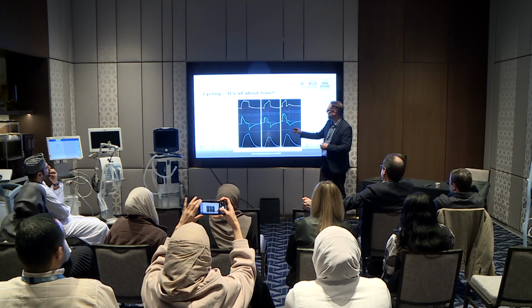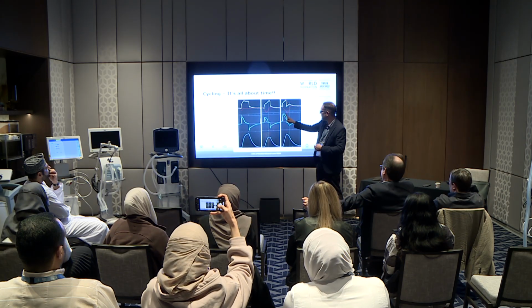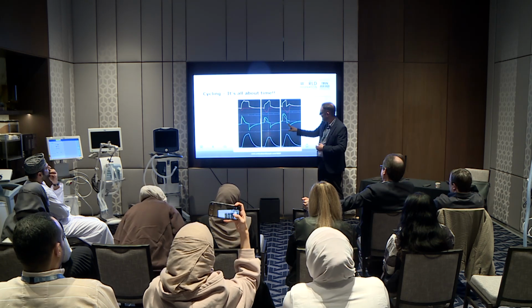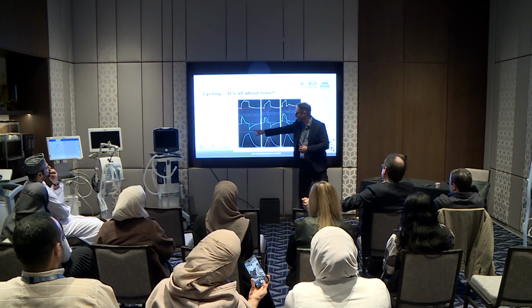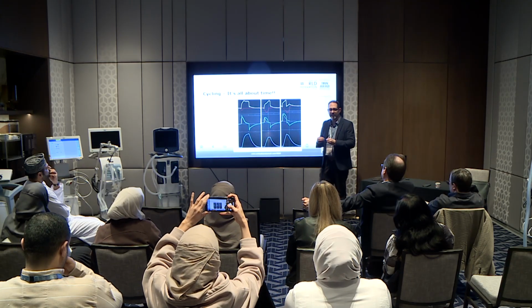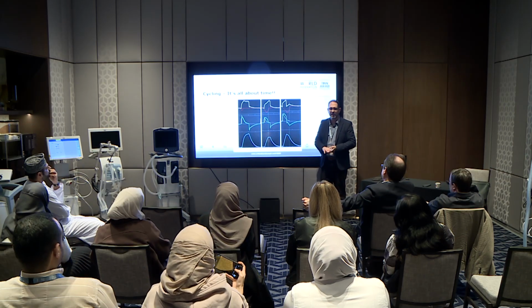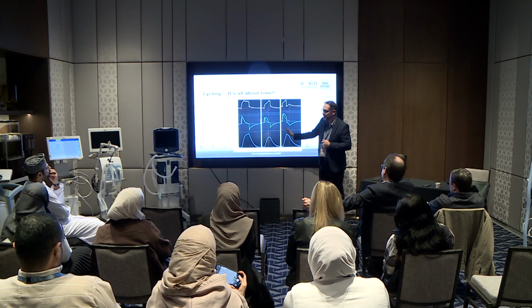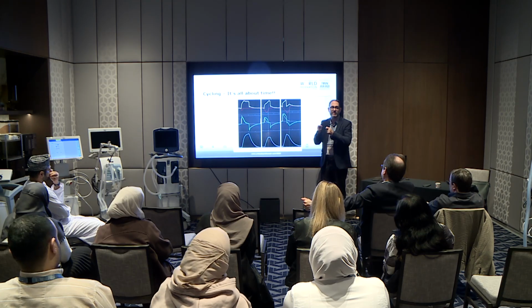And then early cycling, you'll notice the ventilator cycles off here, where this red line is. And how do I know it's early? Well, the expiratory flow will be blunted. Notice how there's a spike. When you see it rounded or blunted, it basically indicates that effort is continuing on past the point at which the ventilator cycled off. So the brain wants to breathe this long, the ventilator cuts off here and says, I'm done, because I've told the ventilator to cycle off. Again, these are settings that we control.